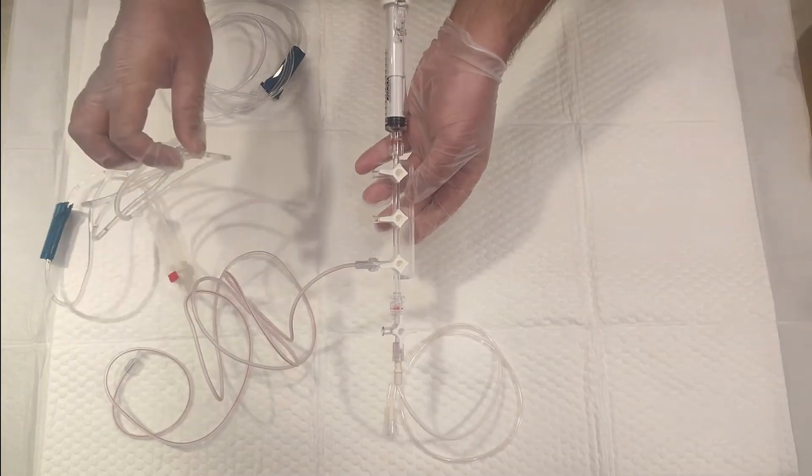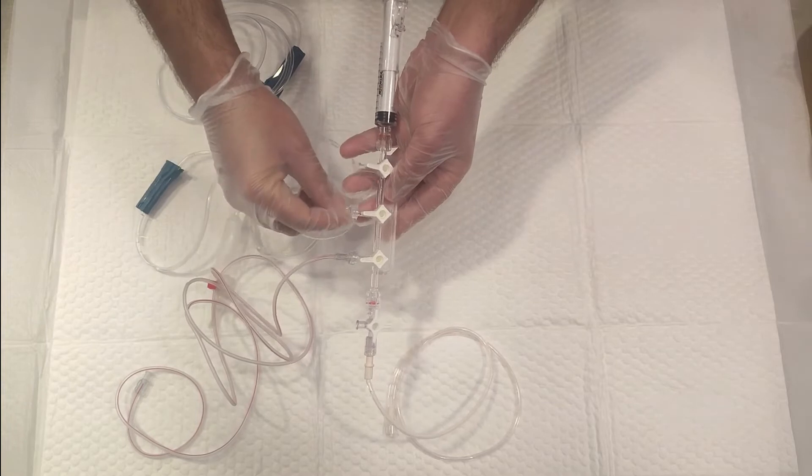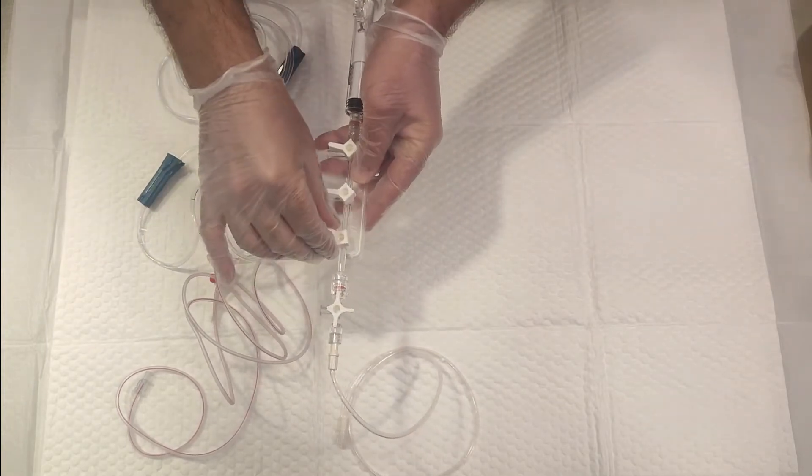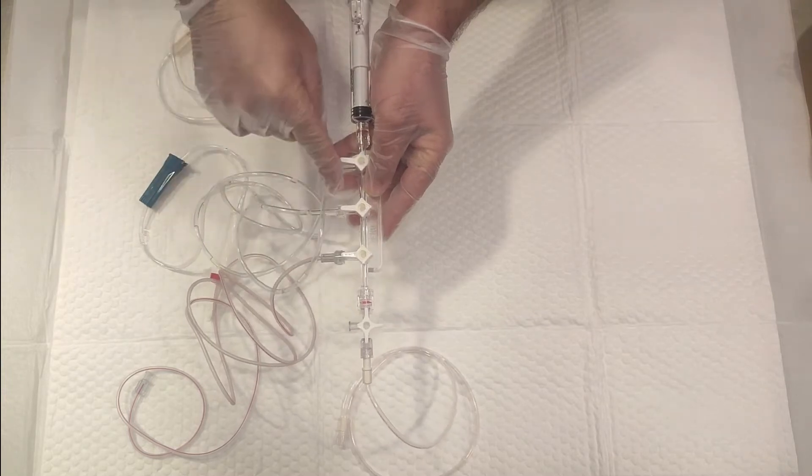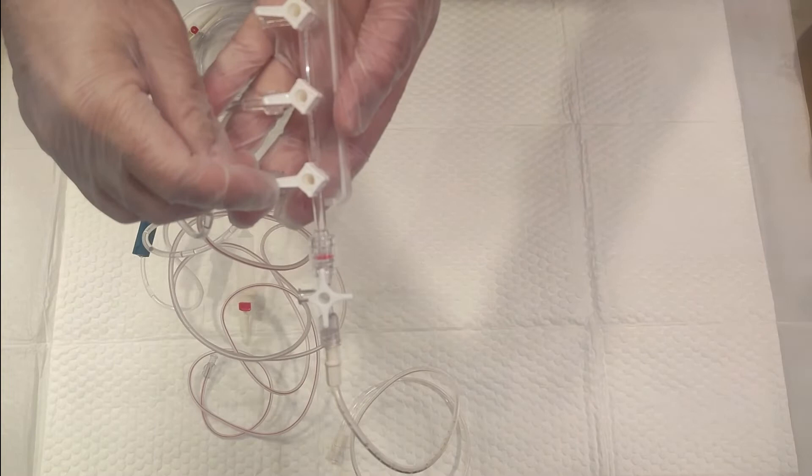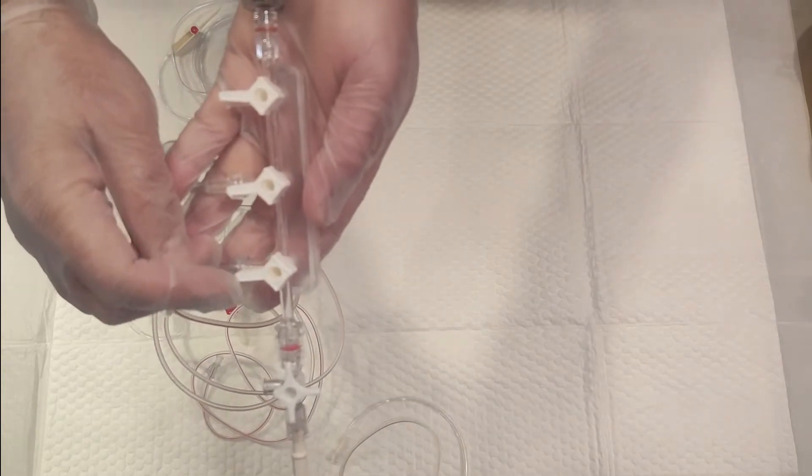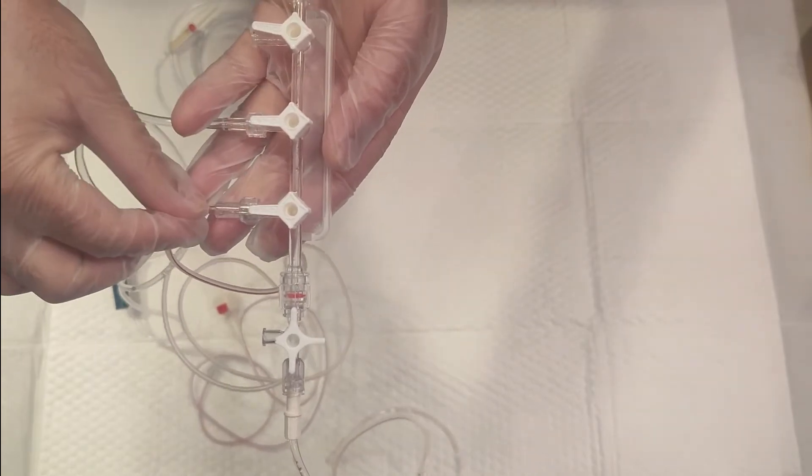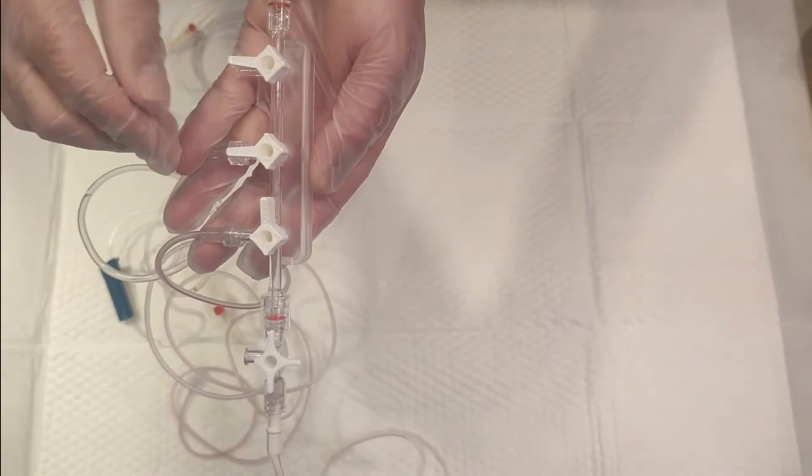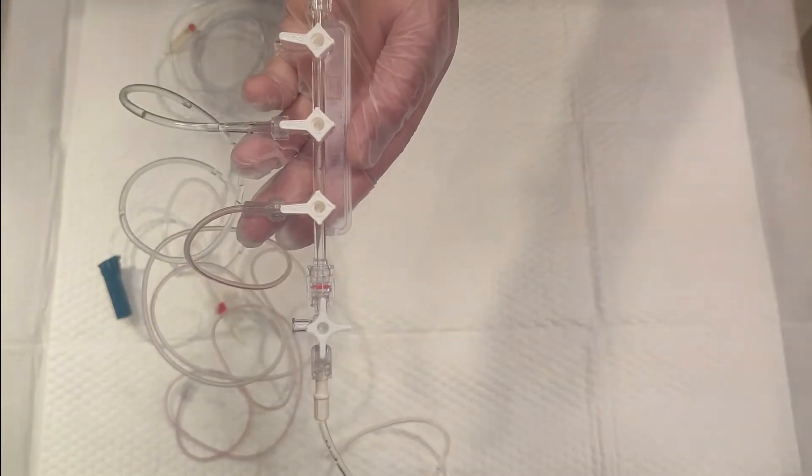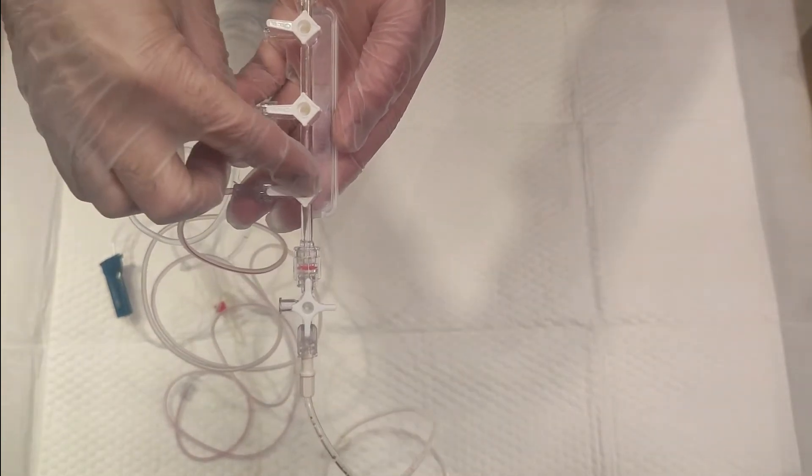The second one is the saline tubing line, similar to this. This sign means it's locked towards the pressure. As you can see here, it's written clearly: 'off' means off towards any side. If it's like this, it's off towards the operator. If it's this way, it's off towards the pressure monitoring. The other ports are open.